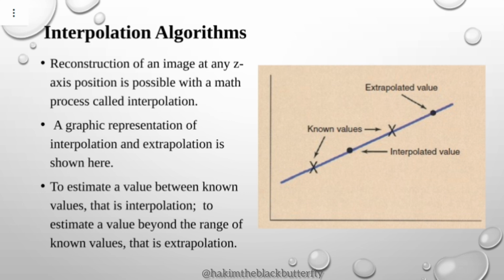As the patient is moving through the bore of this machine, information is being collected to get the slices of this anatomy.